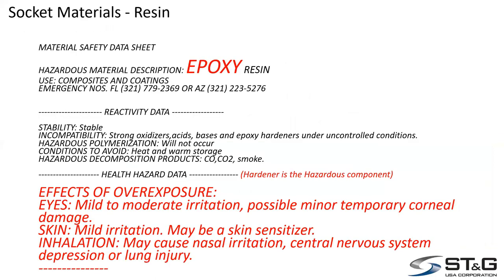When we look at epoxy, for the most part it is not as deadly as polyester resin. The hardener, for the most part, is usually corrosive. It's still a good idea to have ventilation no matter what resin you're using, whether it's acrylic where it's stinky, or epoxy. Epoxy can also get a little stinky, and it could still be a little irritant to your nasal passages. So always take a precaution.